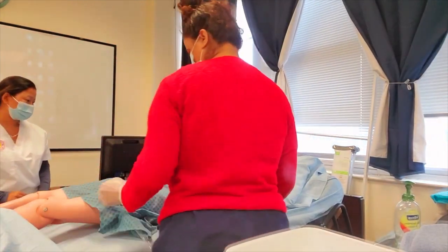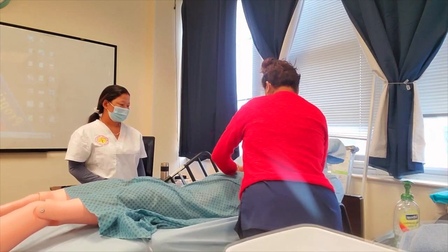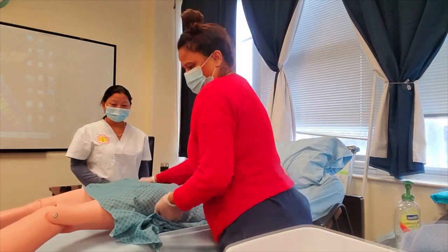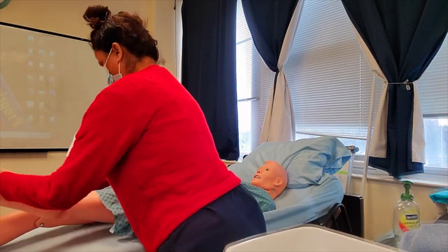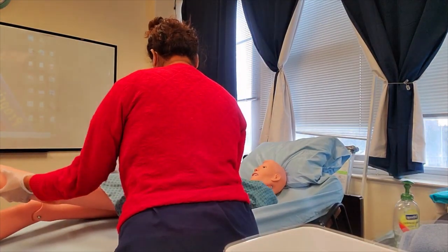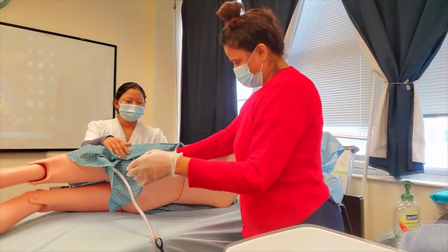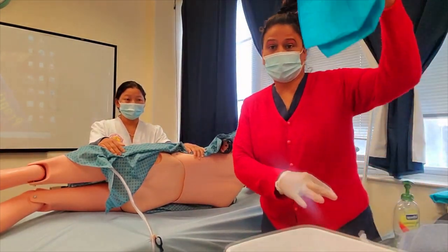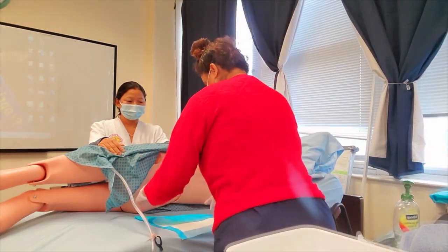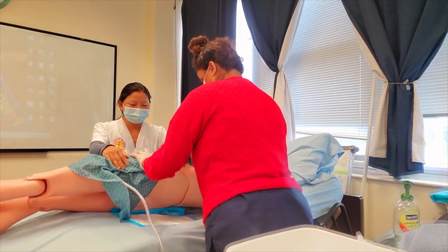I'm going to fan fold the sheet, move my patient closer to me, and on the count of three, place the chuck. One, two, three. I'm going to place the chuck under my patient to protect the linens from getting soiled.